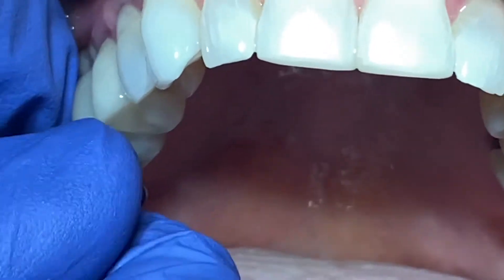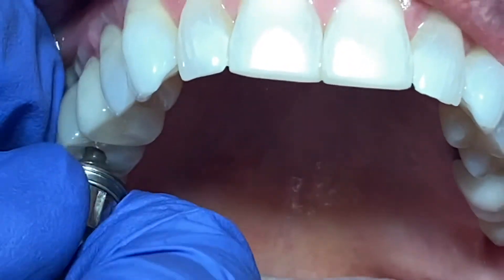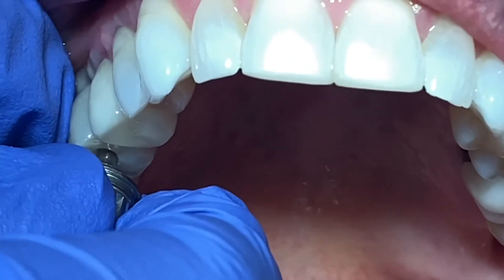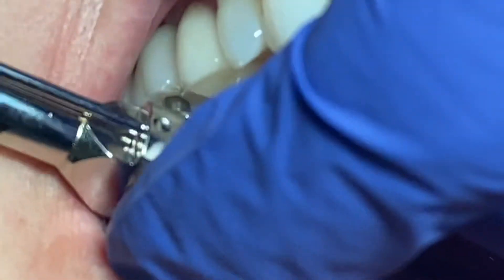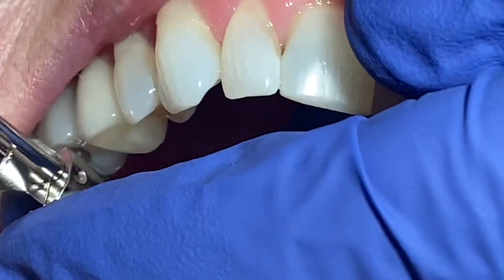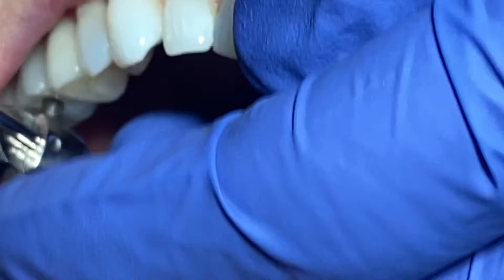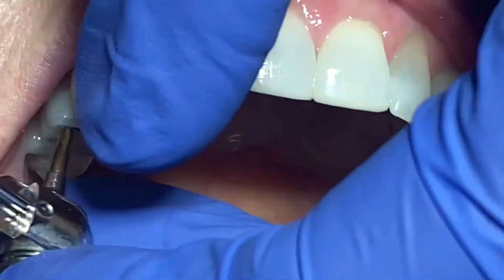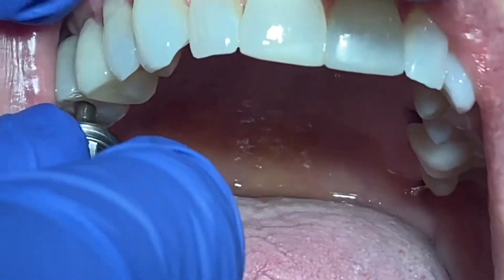Now the implant and the abutment together we can place in and take an x-ray. This is called the screw-retained implant crown — it means the abutment and the crown come in as one piece, which is the lab's job to fabricate. You try it on, check that it fits well.